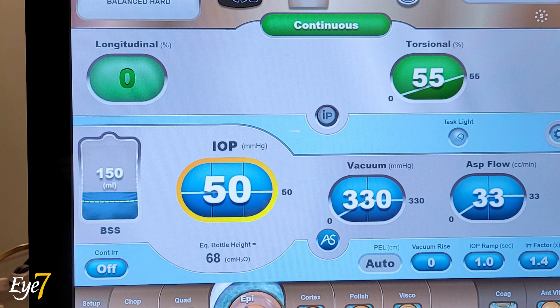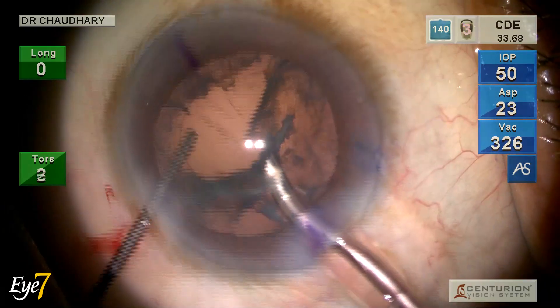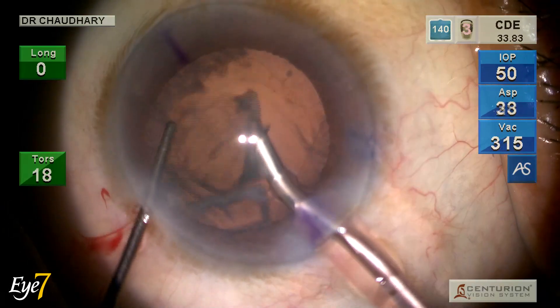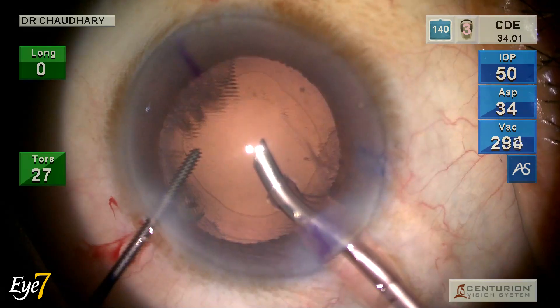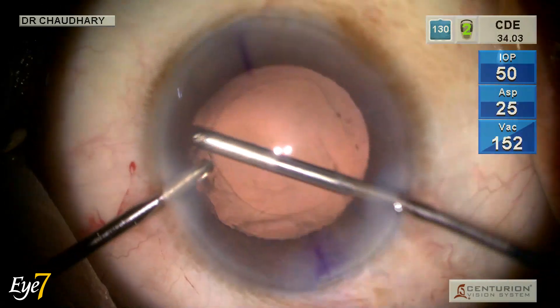These are the settings for epinucleus removal — the torsional values are less, the vacuum is less, and the aspiration flow rate is less. The epinucleus is removed, followed by cortex removal.